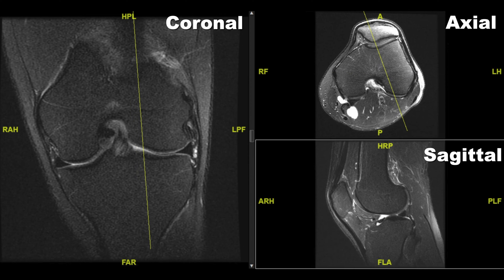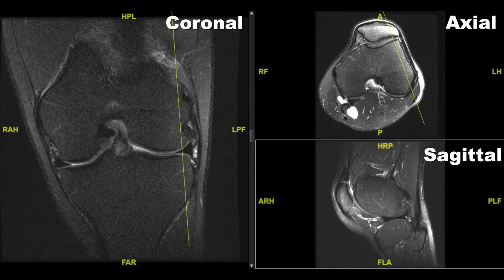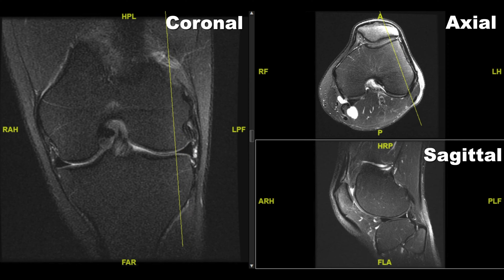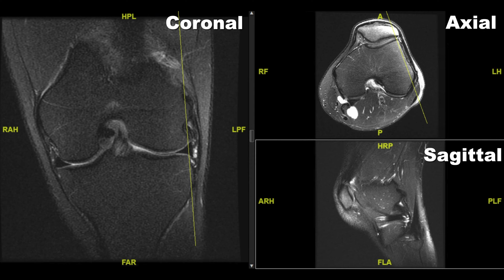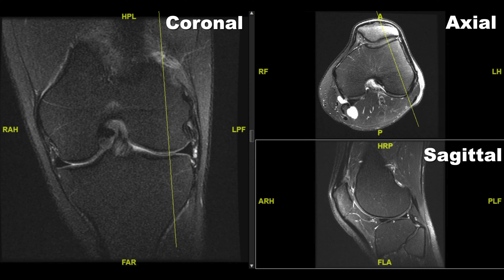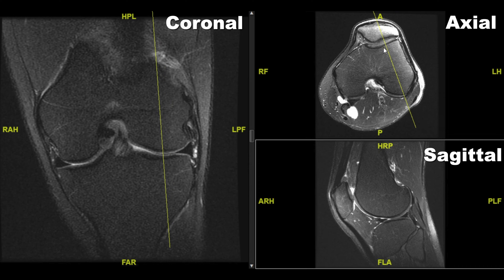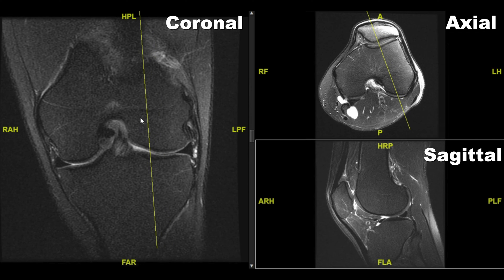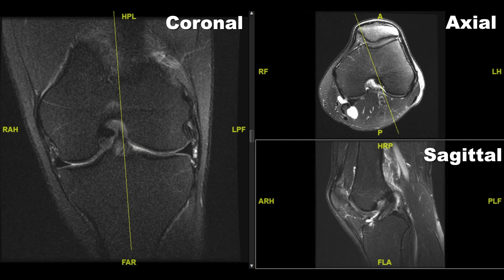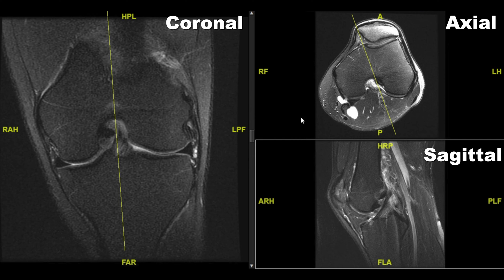Let's do one more example. On the coronal image, here's the lateral side and here's the medial side of the knee. On the axial, here's lateral and here's medial. If we're on the sagittal and we start moving from lateral to medial, you can see the localizer line moving through the knee from lateral to medial on the axial, and on the coronal from lateral to medial as well. Each one of these different images gives us different perspectives on the anatomy of the knee and helps us really localize pathology, injuries, and things like that.